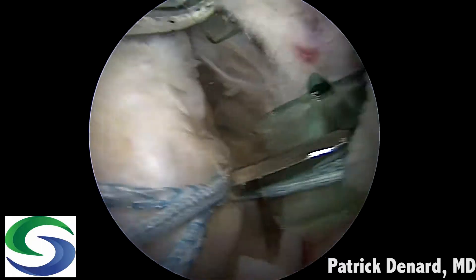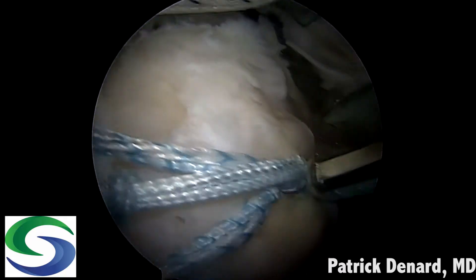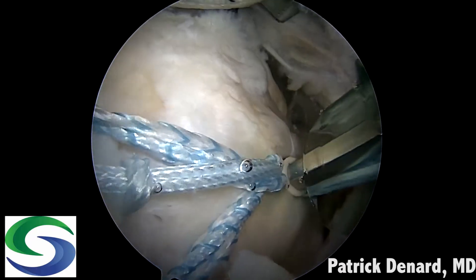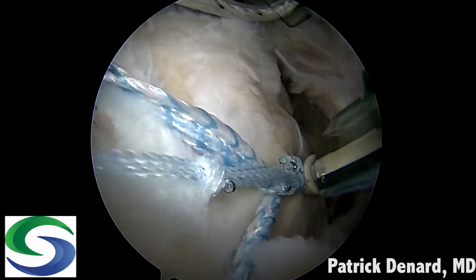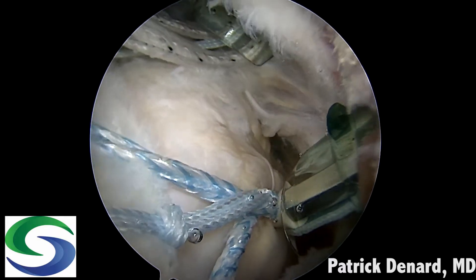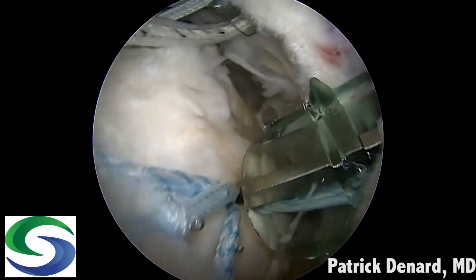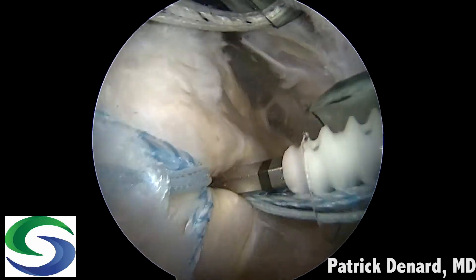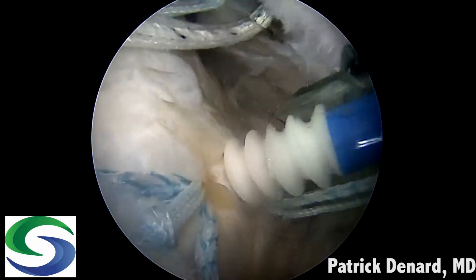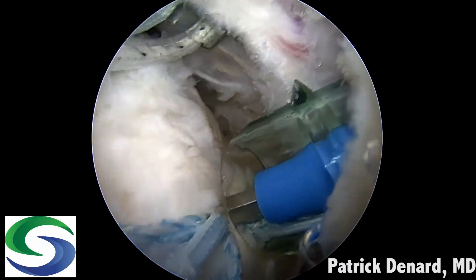When removing that punch we like to hold a cannula in place so we can then take the anchor straight down to the bone socket. The slack is removed as the eyelet is inserted into the bone socket. Once all that slack is removed, the anchor is impacted into place until the threads engage the bone itself. The anchor can be twisted and advanced down the shaft to the eyelet. This is a vented anchor also to encourage biological healing, and the limbs are cut short.